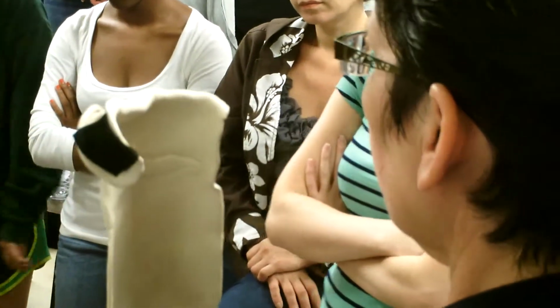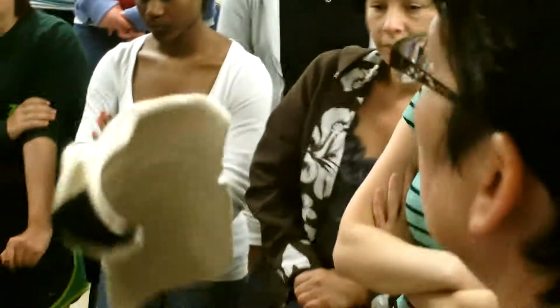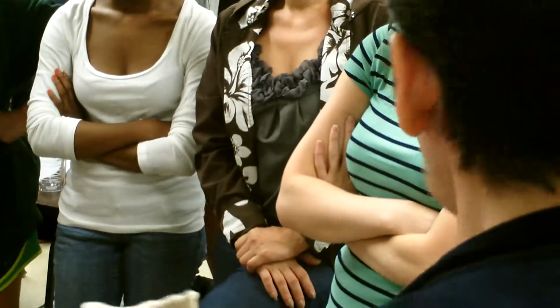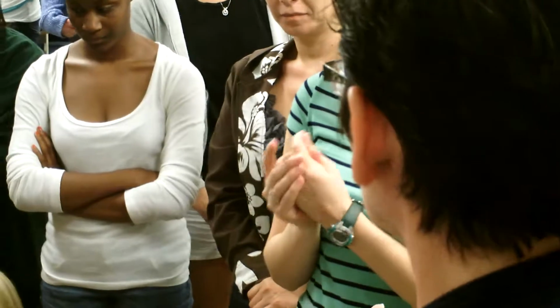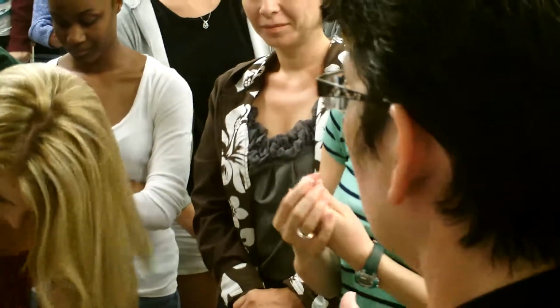Okay? All right. So, this is when I'll yell at you. I'll yell at you when you're not using the right scissors. I'll yell at you, stand up. So you do this, and you go like this, and then you're splinting the patient in midair. What the heck is that? Don't do it, okay? Probably that's the only way I'll yell at you. But it's like a mom kind of yell, okay? The mother still loves you, all right?